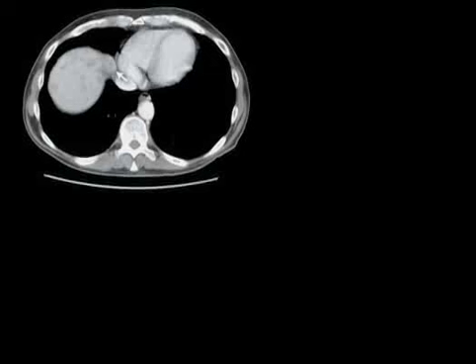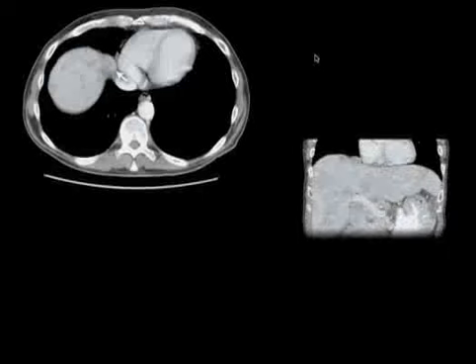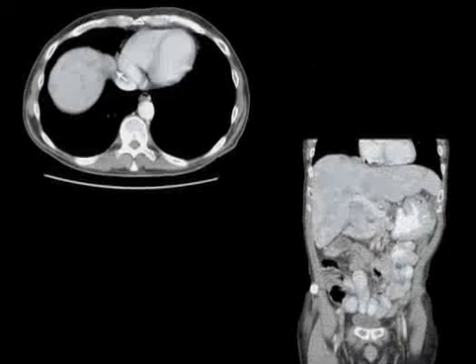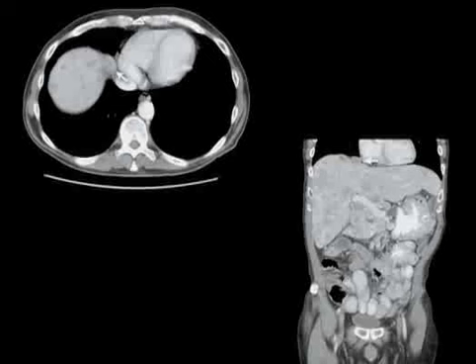Here's an example from CT. This is an axial CT image of the hepatic dome, and you can see several hepatic metastases. There's also an ovoid structure here, and just looking at this image or even scrolling through the data set, it would be impossible to tell where this was located. But reconstructing this in the coronal plane, you can see — as pointed out by the arrow and as I'm outlining here — this is actually located above the diaphragm. That's a pretty routine occurrence with multi-planar reformatting on CT.